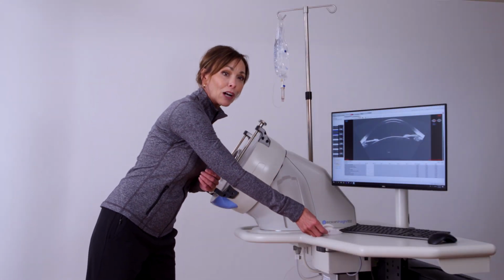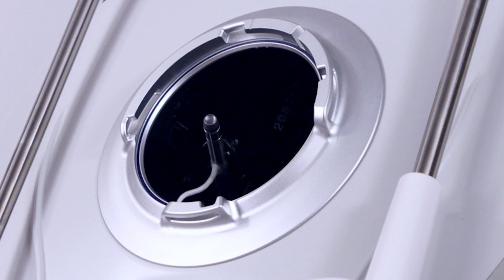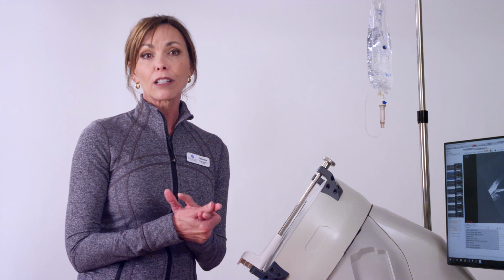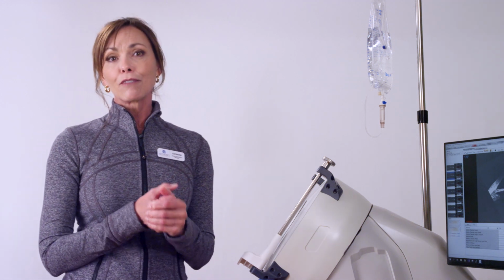Third, the imaging module. In addition to the distilled water, the scan head houses the transducer probe and the motors that robotically move the probe horizontally and vertically on the XY axis and toward and away from the eye on the Z axis. We also have motors that move it in an arc motion to maintain that perpendicular position to the eye. Also within is the camera so that you can see the patient's eye while you're scanning, as well as a fixation light for the patient.